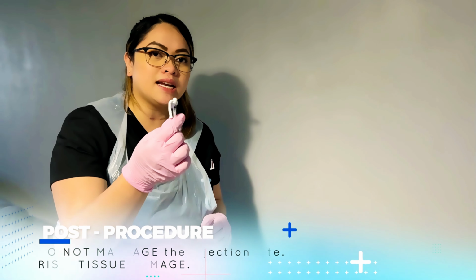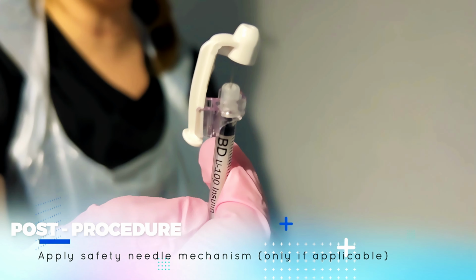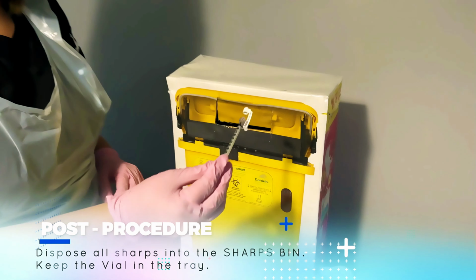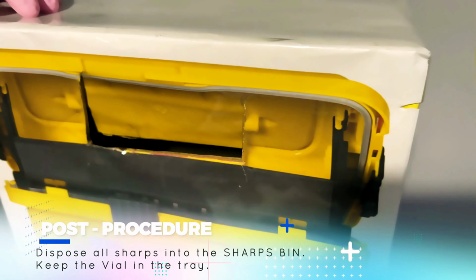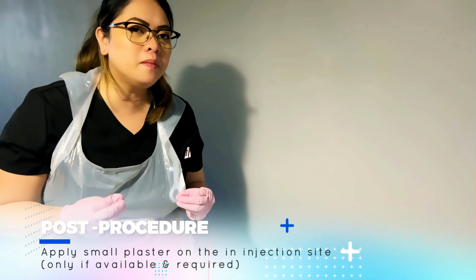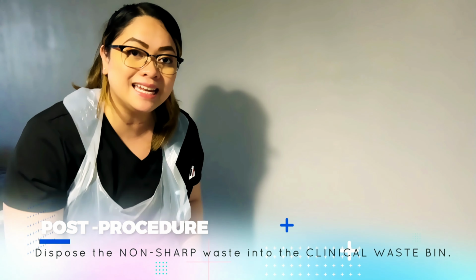Now for this insulin syringe, I need to apply the safety mechanism, which is like this. There you go. It's now safe. So I will put this directly into the sharps bin, okay? If you also have a plaster provided during your exam, you can put it on after the injection to prevent bleeding. But normally, most of the time they don't. Okay, so now I have disposed of the sharps, and I'm going to dispose of the non-sharps in the clinical waste bin.